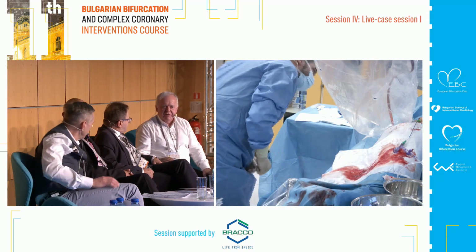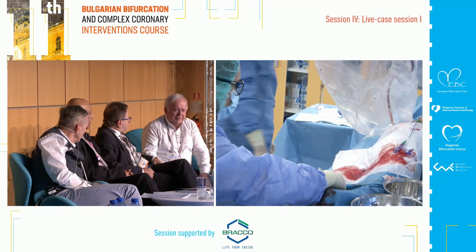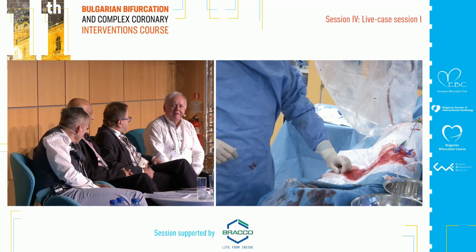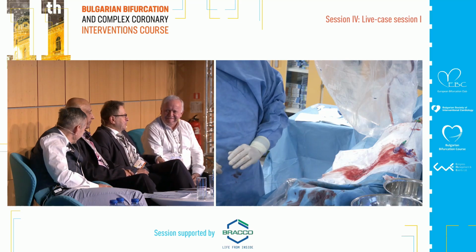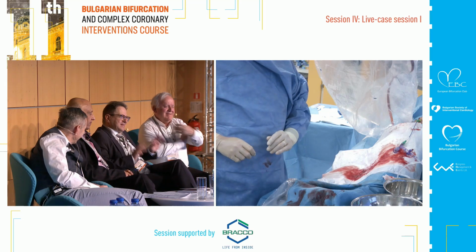I inflated frequently in the diagonals 30 seconds, but in the left main, never more than 20 seconds. So it's just a rule.